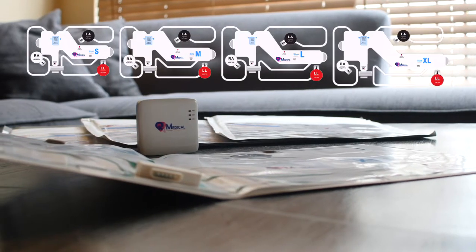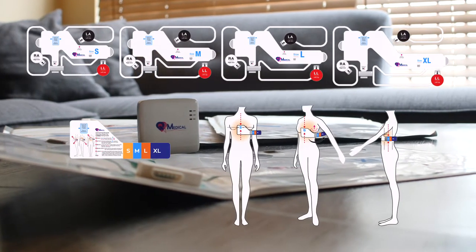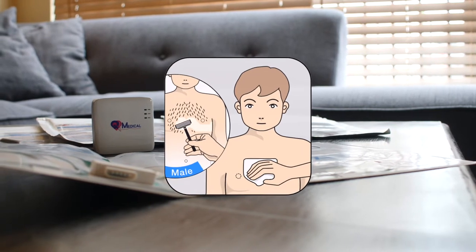To do an ECG test, first determine the appropriately sized electrode strip. Refer to the video titled Sizing Guide. For men with hairy chests, please shave hair along the indicated area.